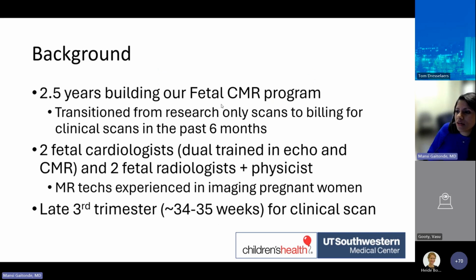So we're about 2.5 years into building our fetal CMR program. We've transitioned from research-only scans to billing for clinical scans in the past 6 months. The team consists of me and one of my colleagues, who's another dual-trained fetal cardiologist, and then we have 2 fetal radiologists and a physicist. When we started this program, our MR techs had already come in with some experience imaging pregnant women, and I do think that's very important.